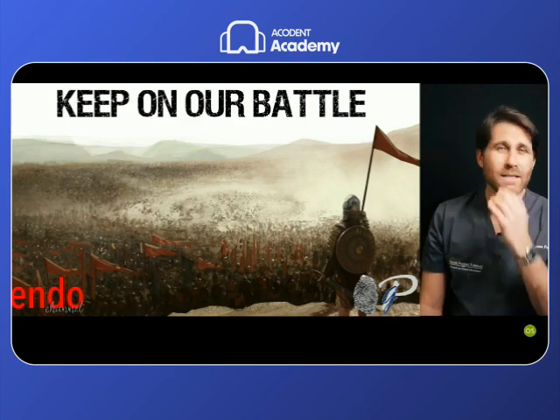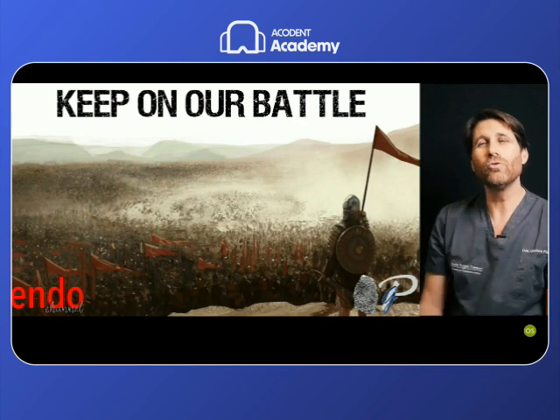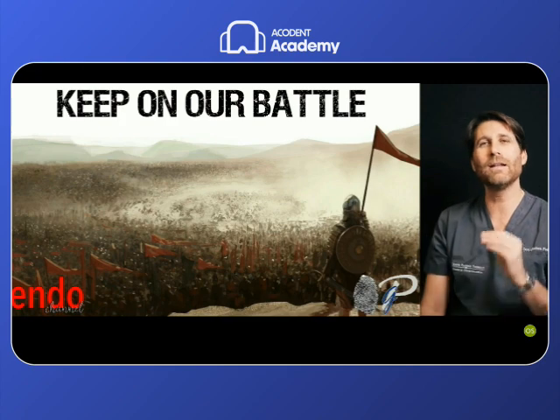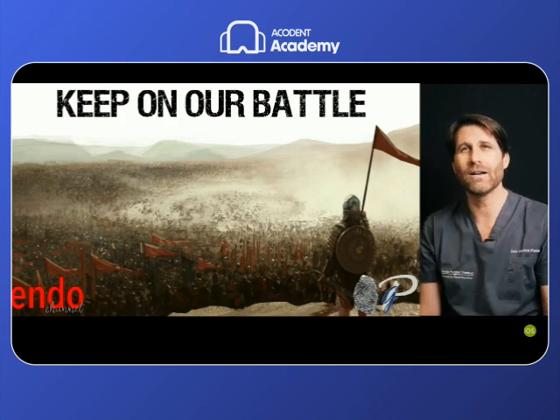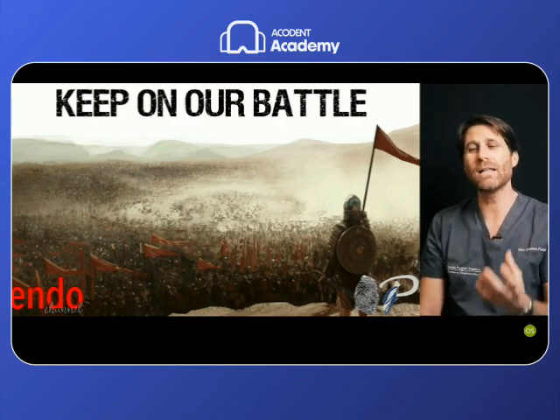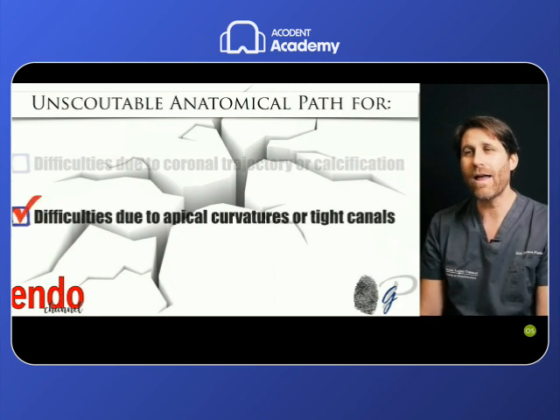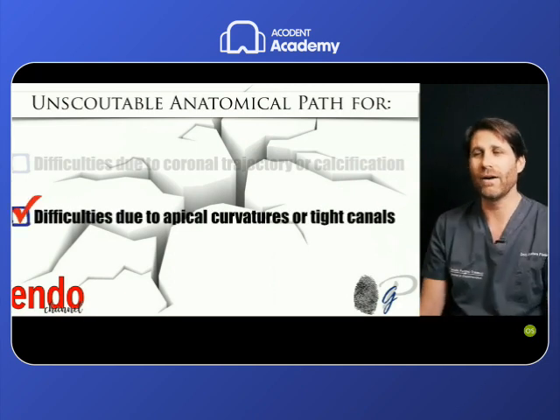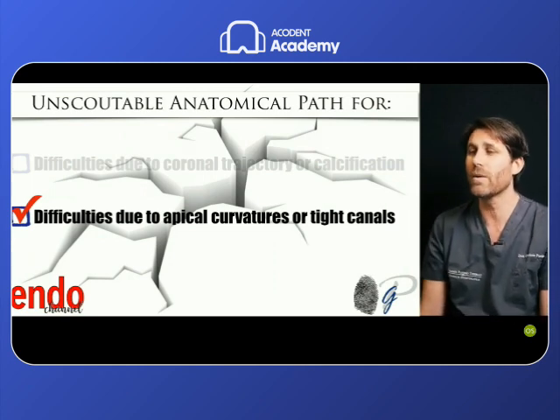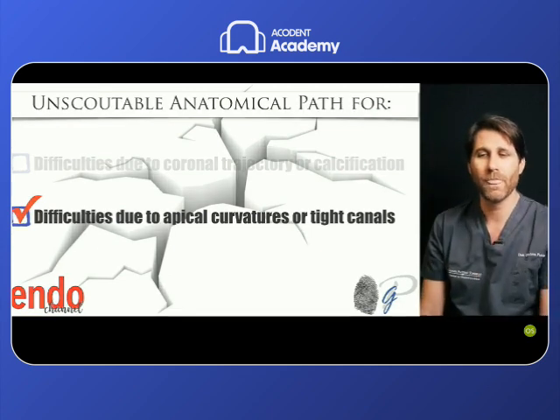In primary treatments, I use more the Reciproc Blue instruments. But before using the Reciproc 25 instrument for the apical scouting, I prefer to fight my battle in a different way. So I try a different technique in primary treatments, because I prefer to use a more delicate instrument and a more delicate technique to try to scout the unscoutable anatomical path, due to the presence of anatomical curvature or tight root canal, especially in the apical third.